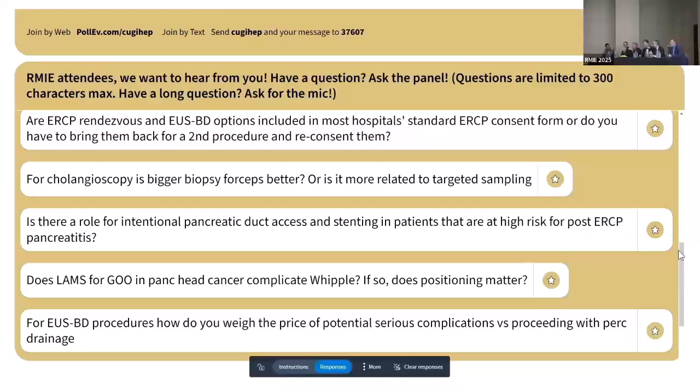But I think it's harder for the fellows, particularly, to be able to maneuver with a pancreatic stent in place than with just a pancreatic guide wire. So I think that's what we would do. But you have to be careful, and it is a trade-off.